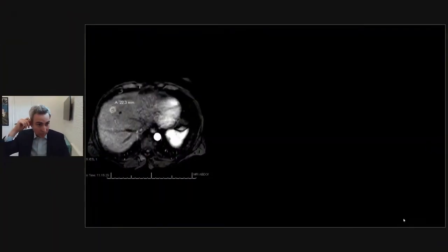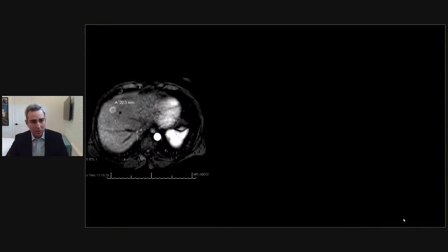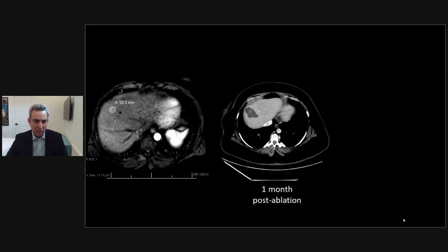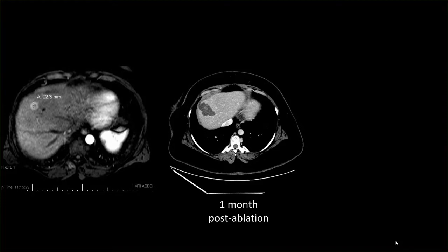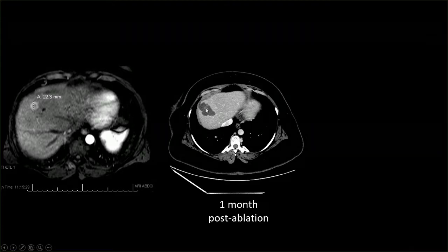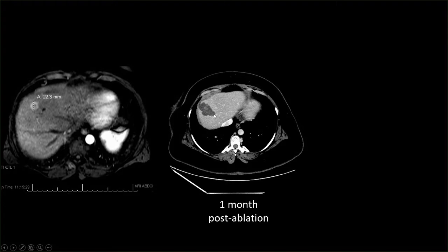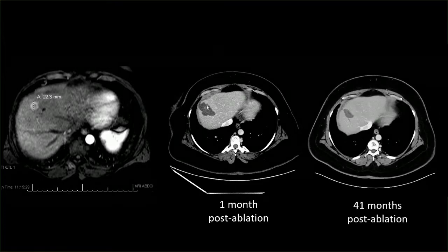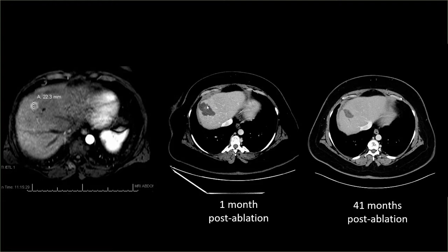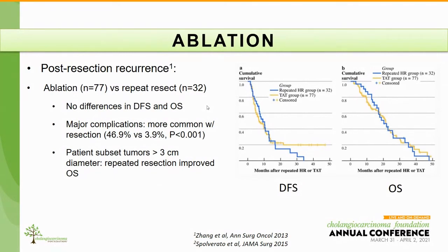This is a typical patient we treat with ablation. The patient had a solitary tumor measuring about 2.2 centimeters on the right hepatic lobe, as you can see on this MRI. We performed the ablation — this is the first CT scan after ablation, where you can see the coagulative necrosis cavity replacing the tumor. This patient has been without any recurrence for the last 41 months since the ablation.